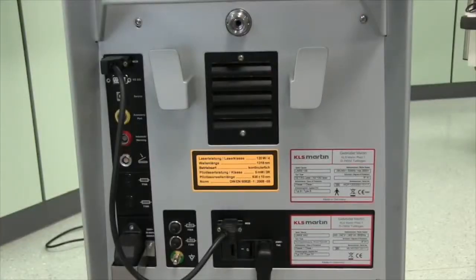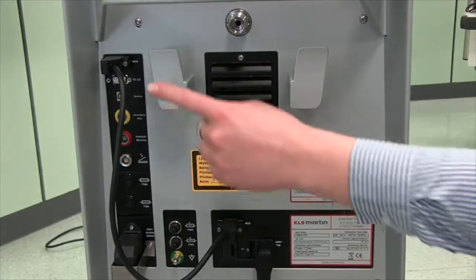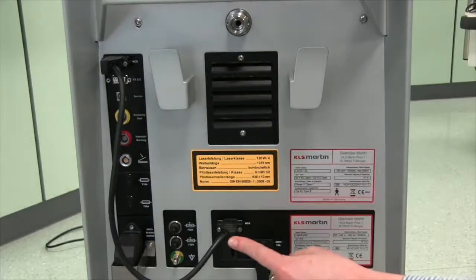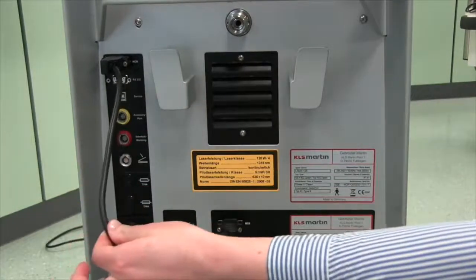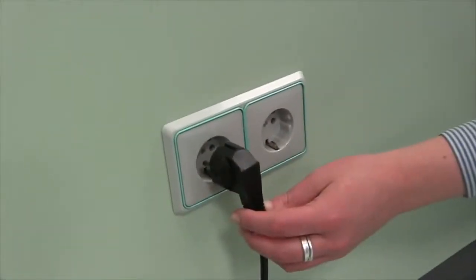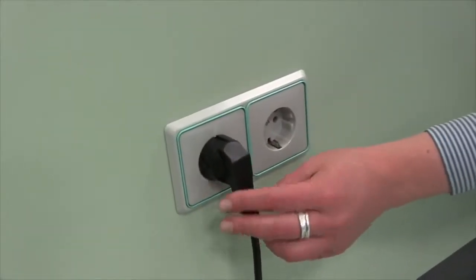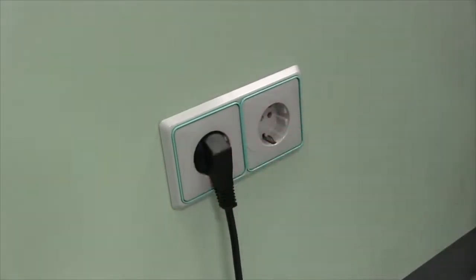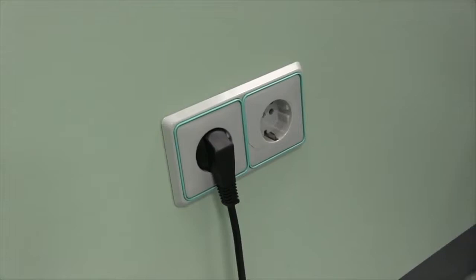If the smoke evacuator is used for the Limax 120, the MCB interface laser needs to be connected to the VAC interface via MCB cable. Now, the smoke evacuator needs to be connected with the power supply system. It is mandatory to use a separate socket.